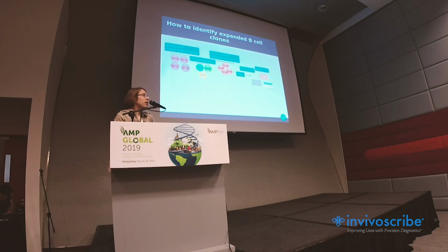You have mostly 3 kinds of clones in your sequences. There are clones with intraclonal diversity, arising from the same subset, with mostly the same sequence but minor mutations inside the sequences. Then you have clones without intraclonal diversity, which are also from the same subset but without those mutations, and are thus hard to find. And you have polyclonal cells, which are from different subsets. All of this you have in your sequences.